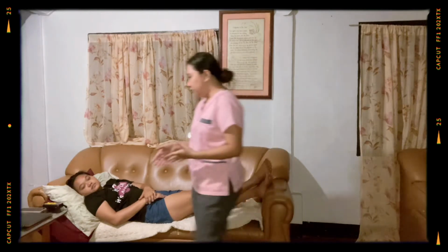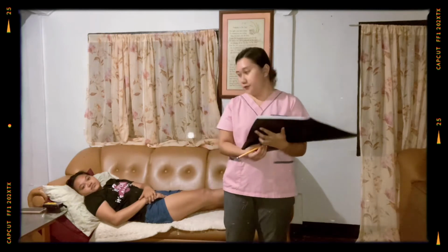So we are going to review them. So this is to assess for tubes, IV lines, incisions, or equipment that may alter the procedure for ambulation, and to assess the patient's knowledge and previous experience regarding the use of a walker. So by reviewing the medical record and plan of care, it validates the correct patient and correct procedure. So checking for the equipment and limitation helps minimize the risk for injury. So that's it.